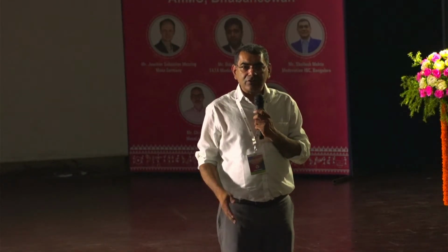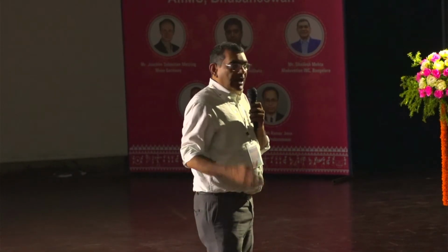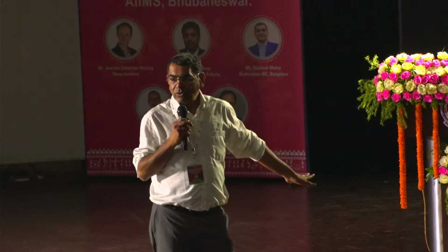So you have to reduce the relative humidity; only then will hydrogen peroxide work and kill. Someone has to understand infection control. आपको ये सब देखना पड़ेगा। बाद में प्लाज्मा स्टरलाइजेशन वो सब टेक्निकल बात करो। बेसिक तो जान लो बायोलॉजिकल को कैसा खत्म करना है, कैसा किल करना है आपको, राइट? तो मैंने तो अभी आधा ही नॉलेज देकर आपको कंफ्यूज करके भागने वाला हूँ। If anybody wants information, please get back. I'll go deep into the subject. Even Mr. Metzing will know how to go deep into that. So you will be able to solve your problems, right?